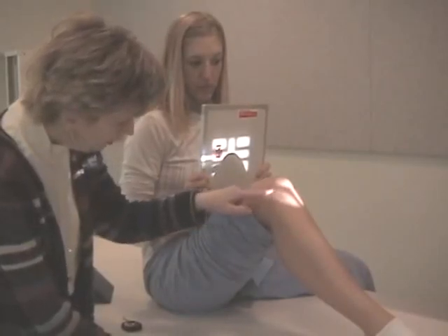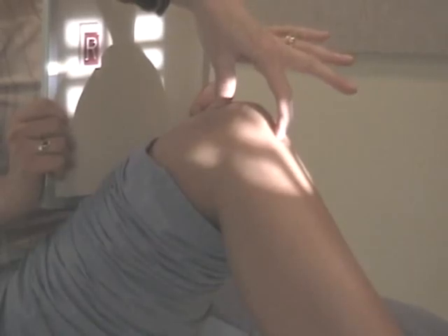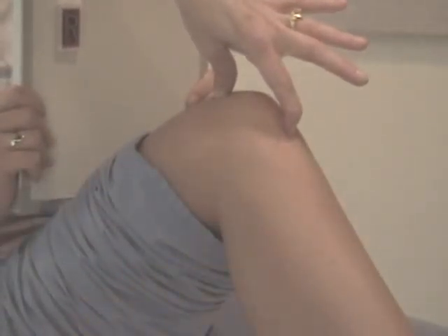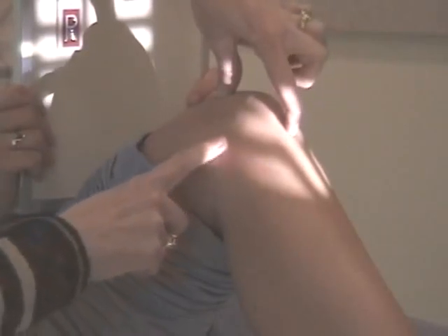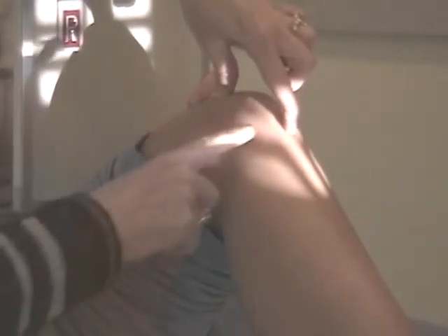Okay, we're going to focus on the angle of the patella right now and this shadow of the crosshair. Okay, she just moved on me a second. There we go. We had it perfect a second ago, so we'll just have to set this back up. I'm going to outline the patella here for you. Here's the base, there's the apex, and you can see that the patella is at probably about a 15-degree angle. Then I've angled my tube cephalic to match that same degree, and I'm looking right at this crosshair here. See the black shadow? It's being parallel to the joint space. That's what you look at to change the tube angle.